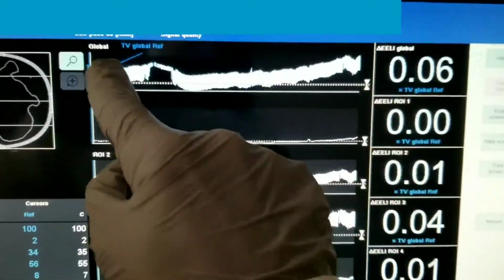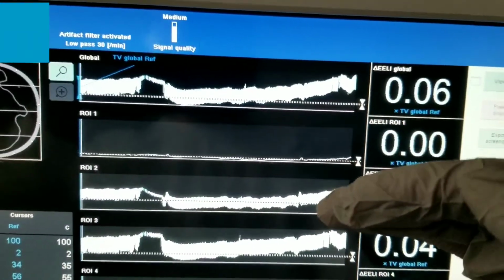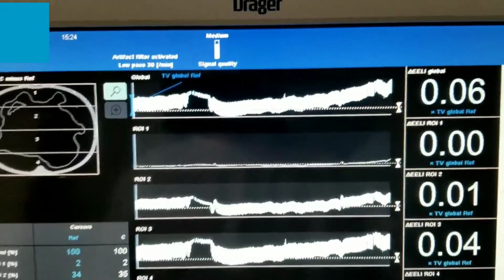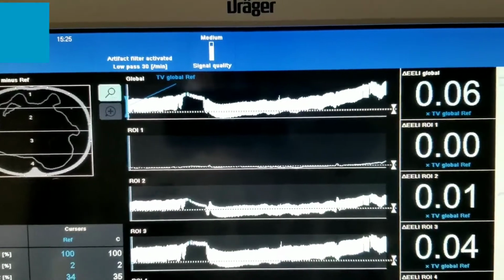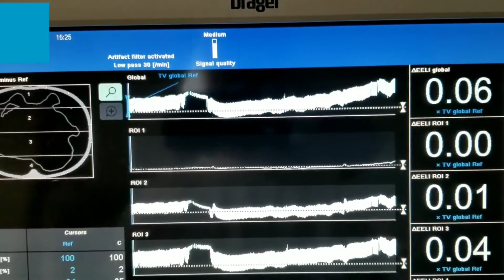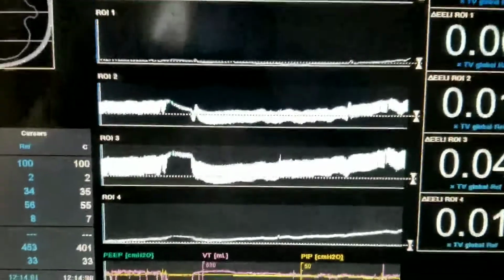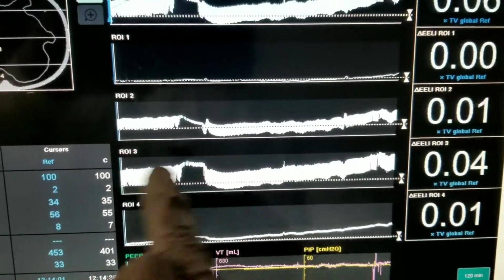So we see that something great is happening here. We've reduced the pressure again, we've reduced the amount of pressure within the lung, and we're actually getting more impedance. Therefore, we're getting better volume. We can probably assume that we did a good move, that we're bringing it down and bringing that lung into a more compliant area in the pressure volume loop. So we want to look especially at the dorsal regions, the mid dorsal regions.